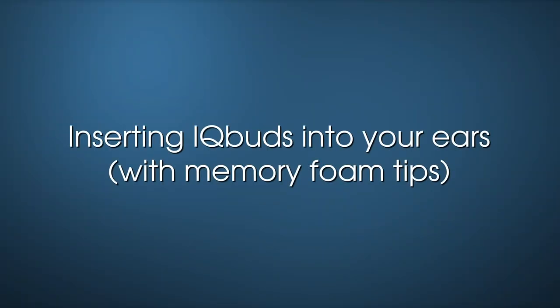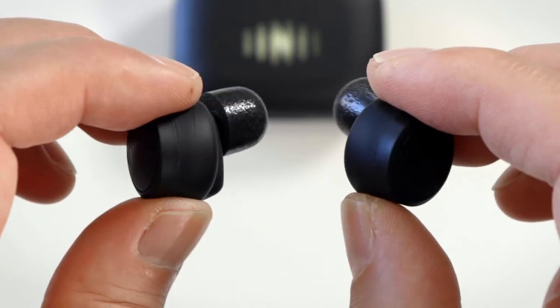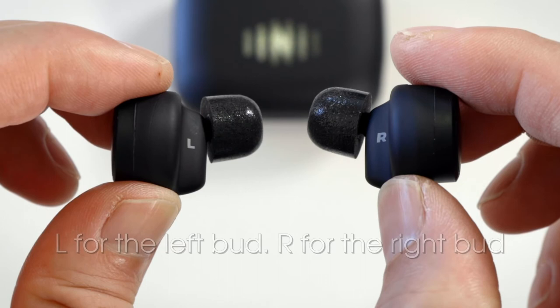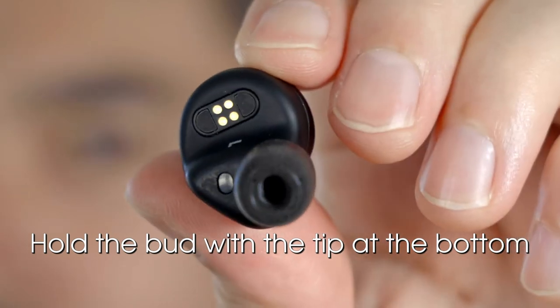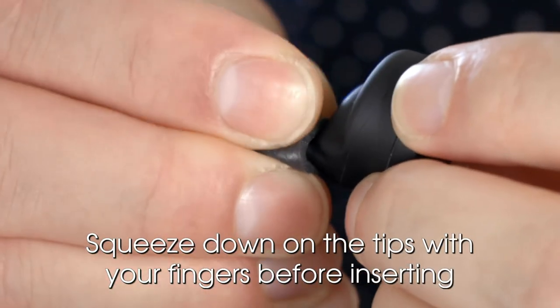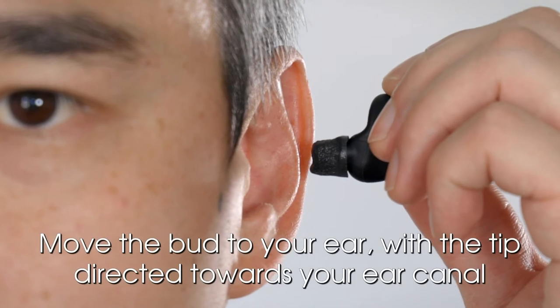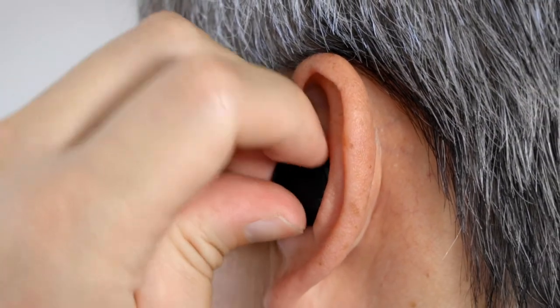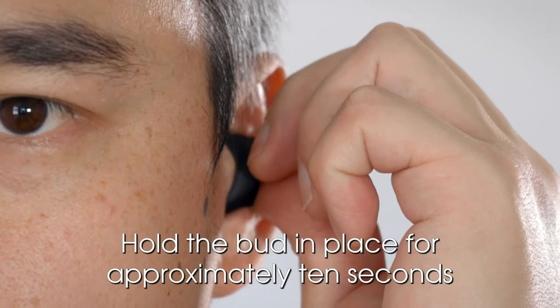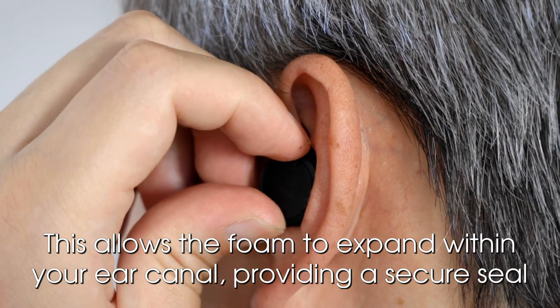Inserting IQbuds into your ears with memory foam tips. First, ensure you are holding the correct bud in the correct hand. Look on the bottom of the buds for the indication: L for the left bud and R for the right bud. Hold the bud like so, gently gripping the edges of the bud with the tip at the bottom. Then press down firmly on the tip with your fingers immediately before inserting it in your ear. Move the bud to your ear with the tip directed towards your ear canal and insert the bud. Hold the bud in place for approximately 10 seconds. This allows the foam to expand within your ear canal, providing a secure seal.